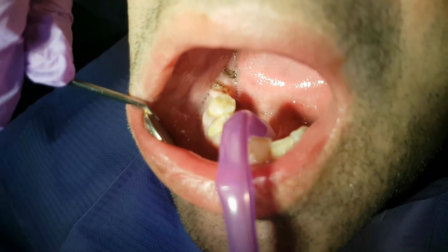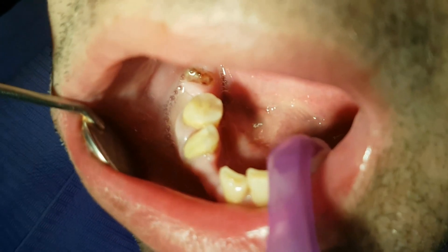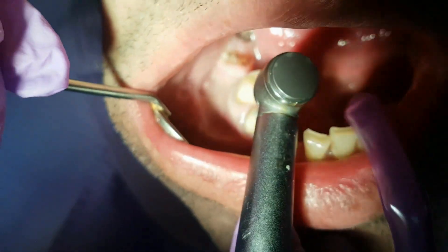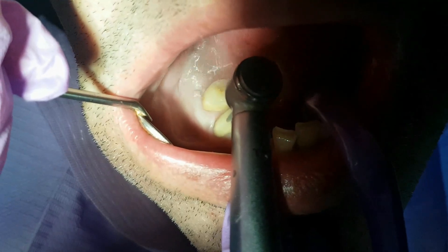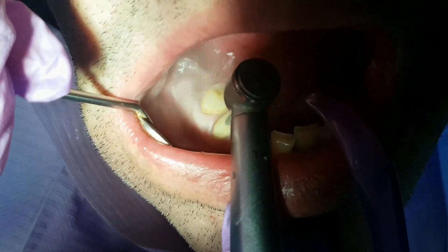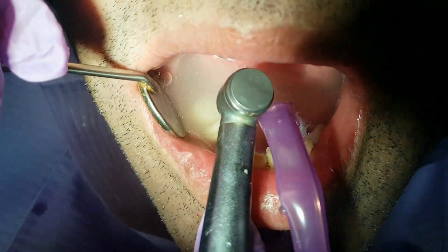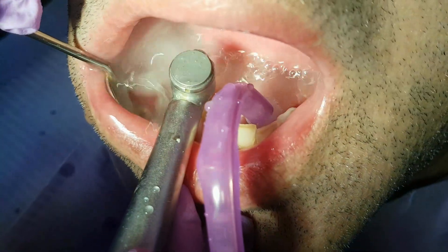This tooth has been previously treated; the pulp has been devitalized using chemical medicine. Now we open up the temporary filling using a turbine and we will proceed with extirpation of the nerve tissue.